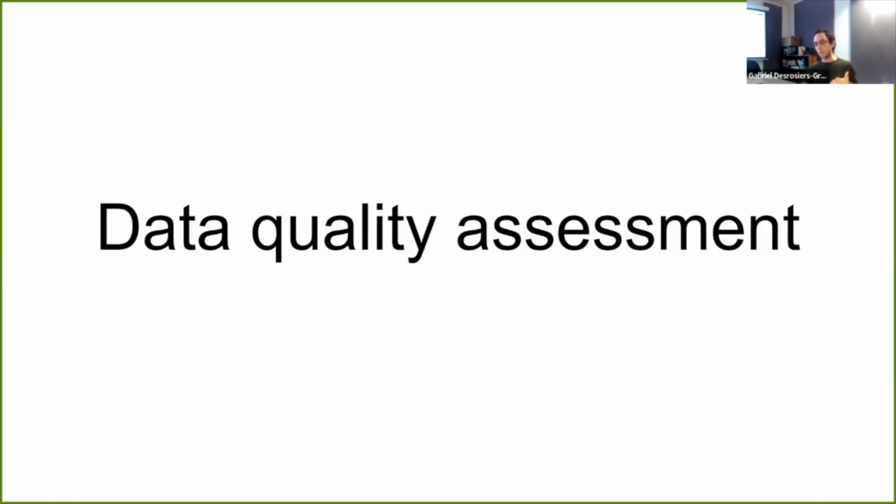But these aren't by any means supposed to be the absolute way, or the only way, to look at data quality. And if you have some discussion points or even criticism to bring up in that section, you're welcome to. I expect this to keep evolving over time as the pipeline develops. But really the goal here is to try to, hopefully as a community over the years, within the RABIES software platform, improve our standards for looking at data quality and really improve the quality of rodent fMRI research over time.